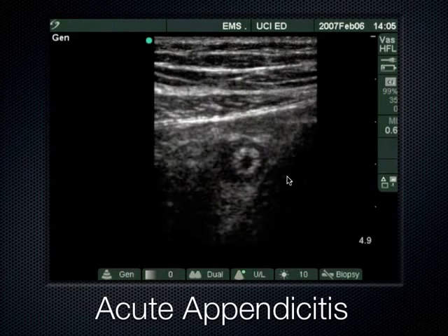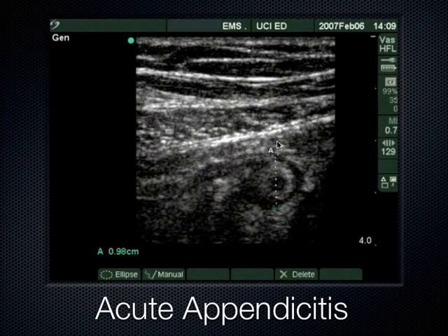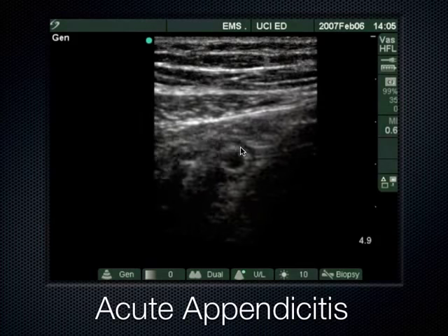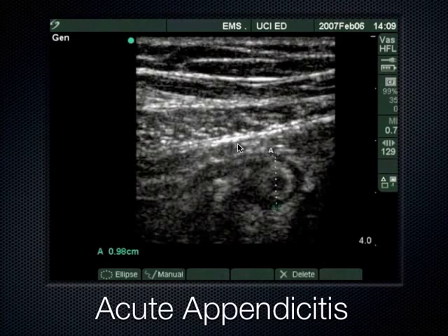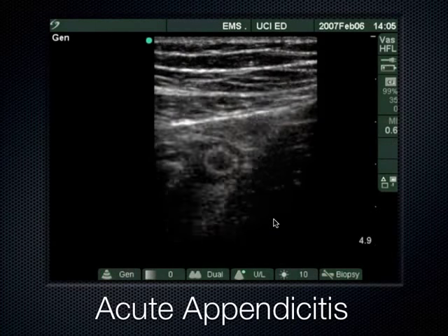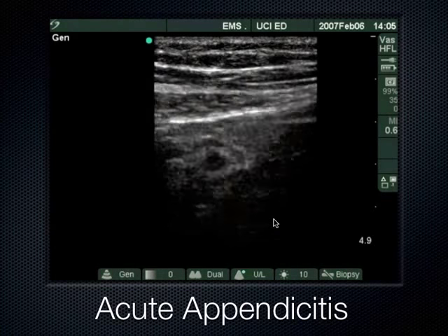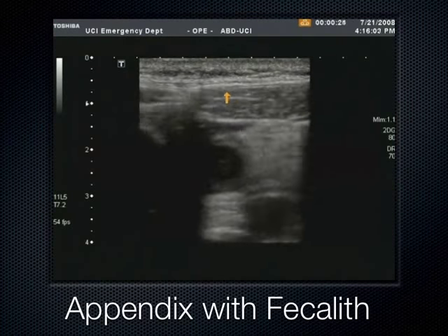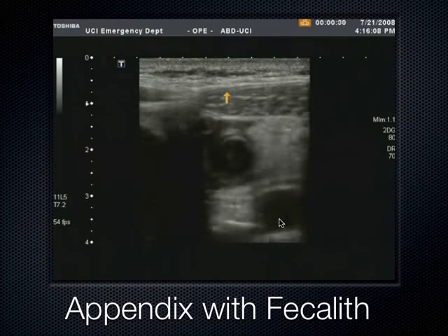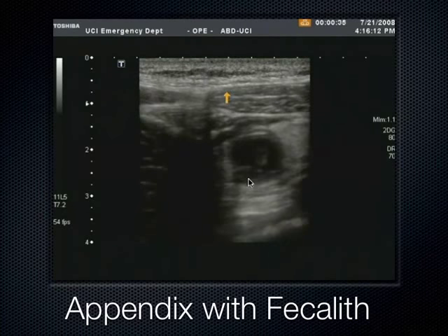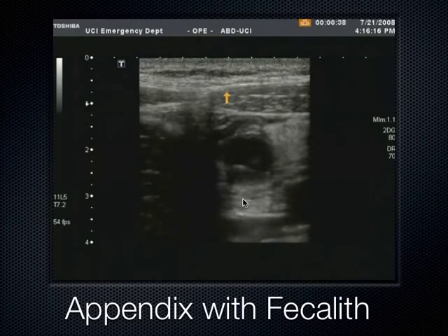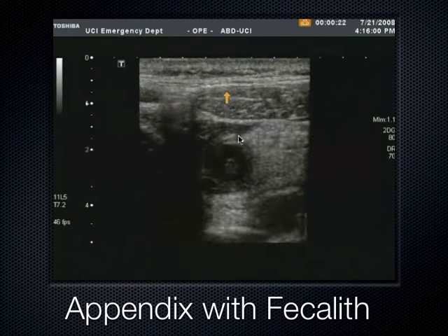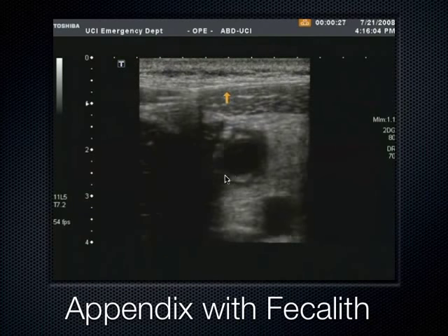This is how intestines look from your esophagus all the way down to your rectum — hypoechoic outer walls. That's always how I know I'm looking at bowel. This comes up all the time; the duodenum seen on end can look a lot like this. This patient has a fecalith — a stone with a shadow behind it blocking this appendix — that's why the patient ended up with appendicitis. Sometimes you'll have trouble finding the appendix only to realize a fecalith is blocking the sound.